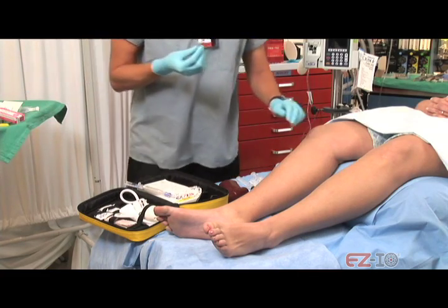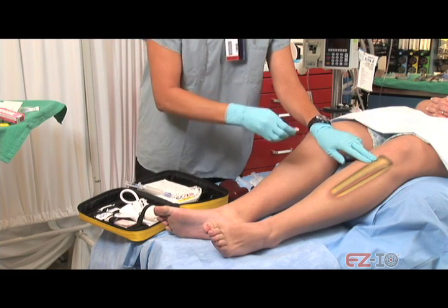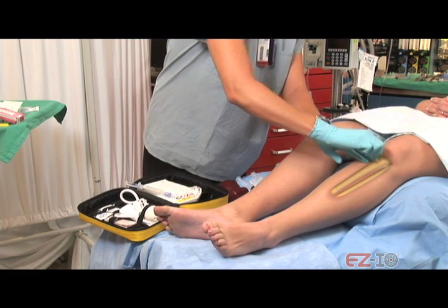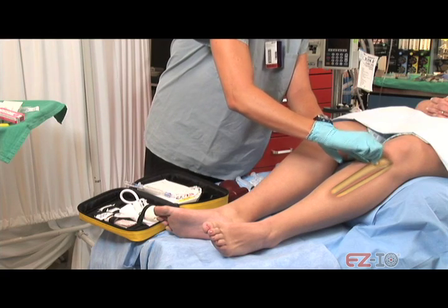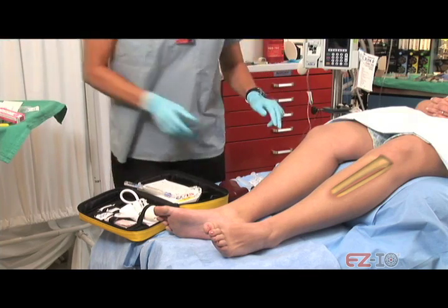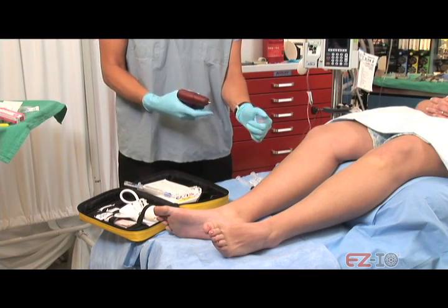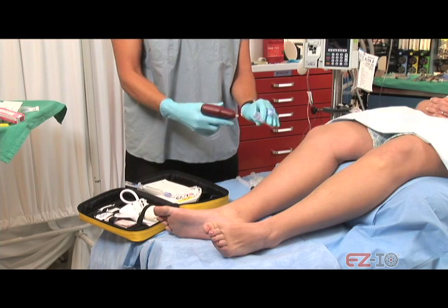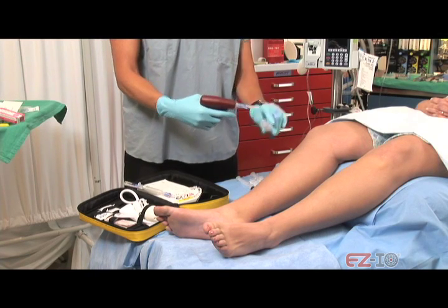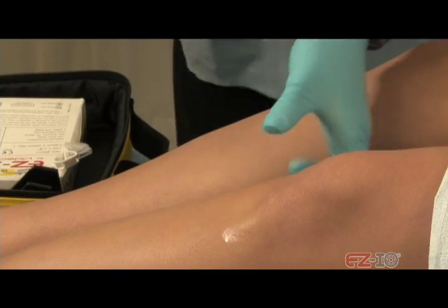Okay, now I'll let you know before I'm going to put it in, okay? I'm just finding the spot where I'm going to put it. Are you ready?